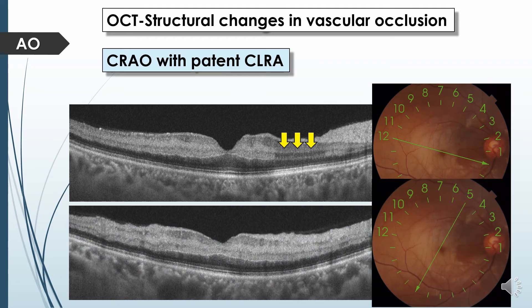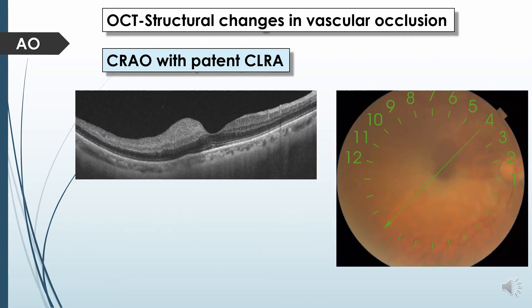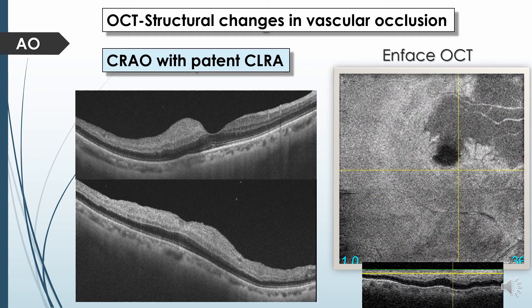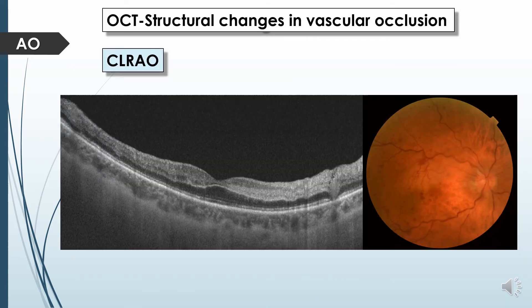Another patient with central retinal artery occlusion with patent cilioretinal artery demonstrates use of the en-face OCT scan at the level of the inner retinal layer, giving an excellent panoramic view differentiating between the perfused area supplied by the patent cilioretinal artery and the hyperreflectivity in the ischemic area supplied by the occluded central retinal artery. Isolated cilioretinal artery occlusion may be seen as a sequela of central retinal vein occlusion, representing a hemodynamic obstruction rather than a mechanical one, secondary to decreased perfusion within the cilioretinal artery.